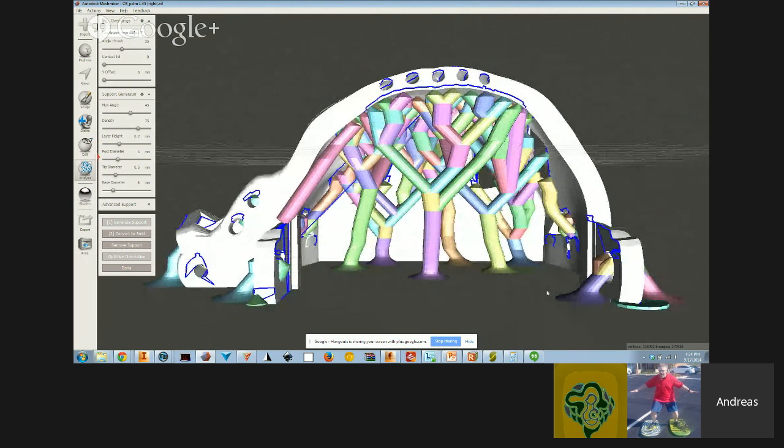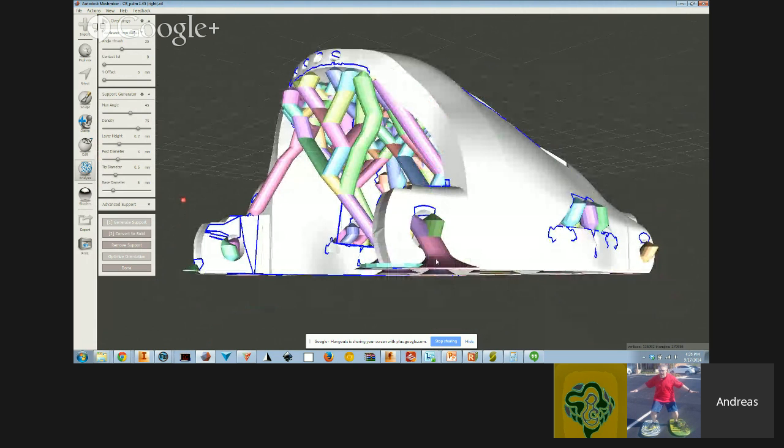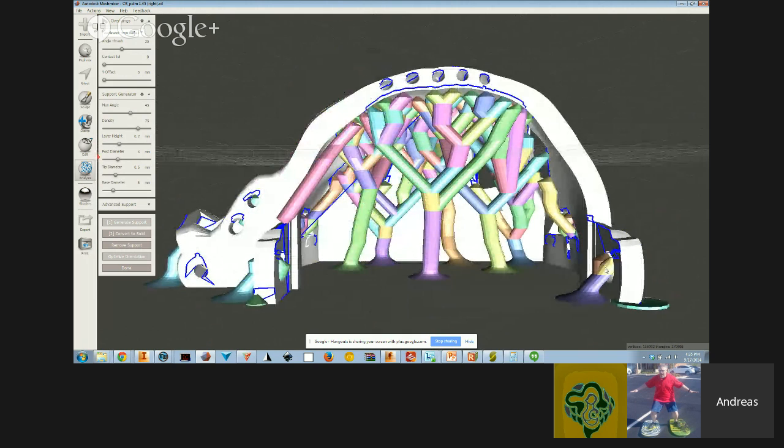I don't need it. Something you might want to do, like in this case, I don't need these supports up here in front, so I can Control-click on them to delete them. Okay. Control-clicking gets rid of these struts, these things that you see. Another thing you might want to do, if it's just too much to go through and weed out, is do it manually, which in this case I probably could get away with much less support. I can tweak some of these sliders and just keep generating support and seeing what I get. And that can be useful. But in this case, I'm just going to try to do it manually.